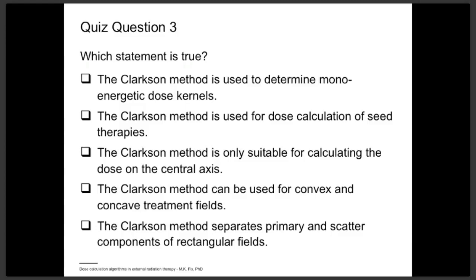Okay, thank you, Michael. While that question is up, we've got a couple of questions here in the chat which I was hoping we could answer. Some of them go back to the TAR method. Up to what energy is the TAR method useful? You find them still for 6 MV, but this is kind of a borderline where many calculations switch to tissue maximum ratio or tissue phantom ratio.